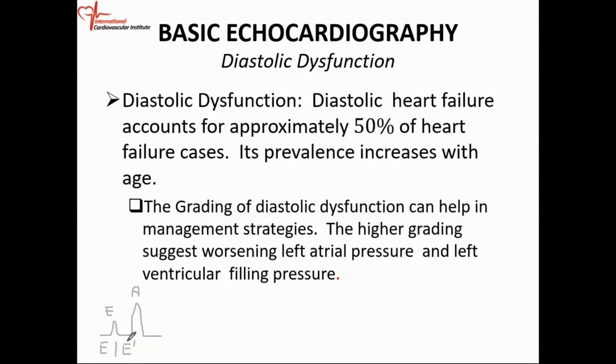So the next thing you're going to look at is your tricuspid velocity, TR velocity, okay? TR velocity, all right? And the last thing you're going to look at is your left atrial volume, okay?